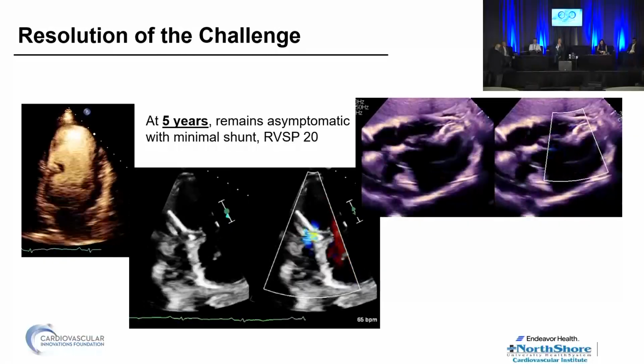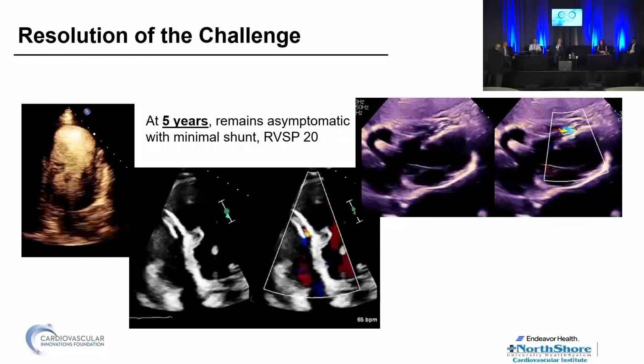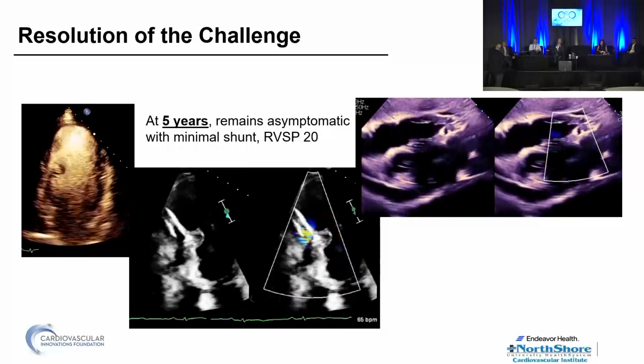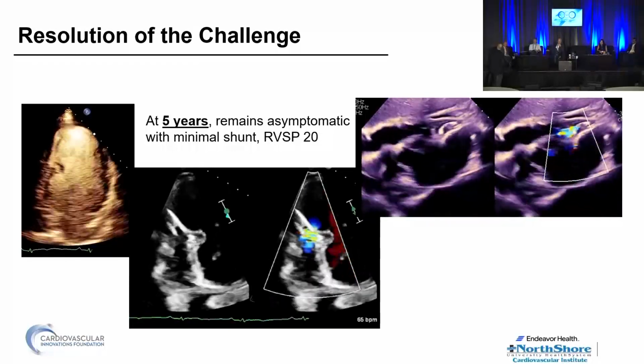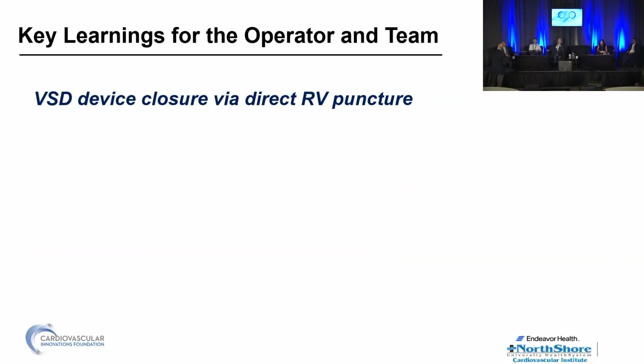And right before getting on the plane, I asked them to do an echo for me at 5 years. And you can see there's a tiny bit of a residual leak. It's been that way since essentially day one. But she's done remarkably well with this. And the surgery was nothing to recover from.